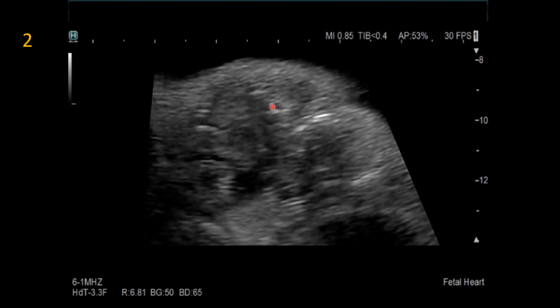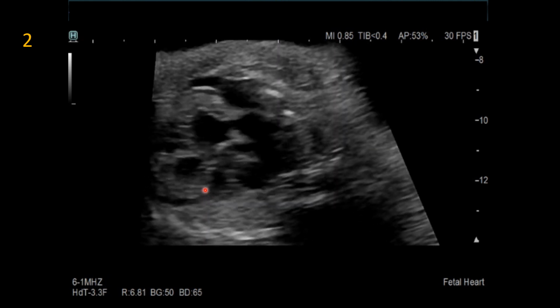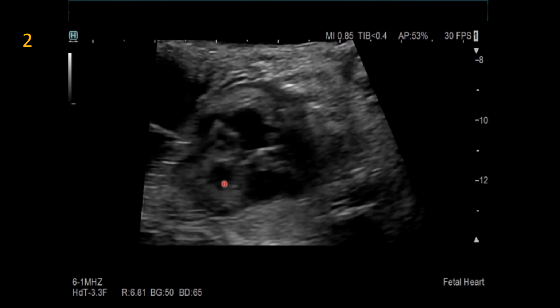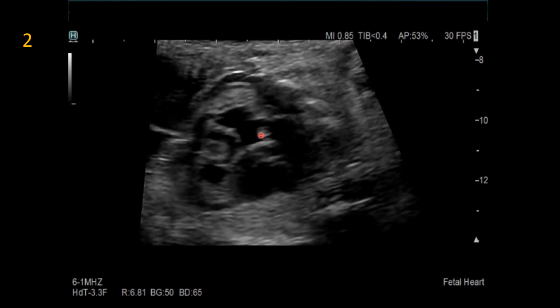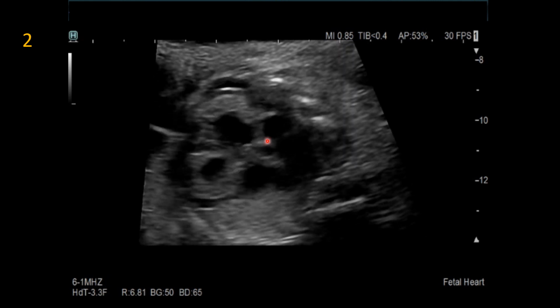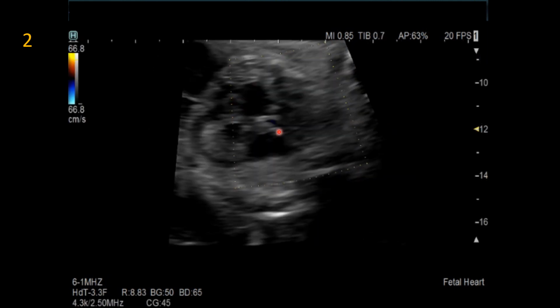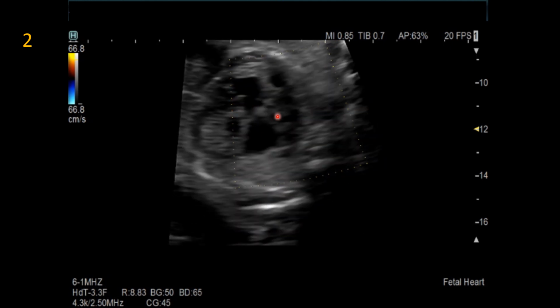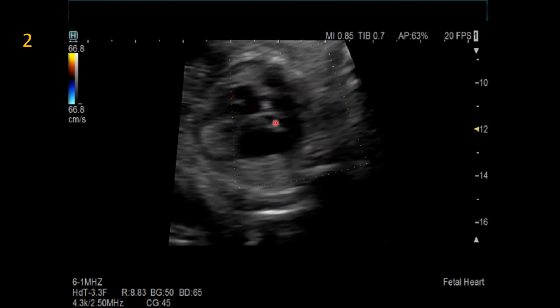Different angle. This is still sort of a parasagittal kind of an axial cut here. You see the left ventricle here, the right ventricle, and this outflow tract is the aortic outflow tract, the aortic valve here, and posterior to that is the pulmonary artery here, smaller in diameter than the aorta, but double outlet right ventricle here with color Doppler. You can see antegrade flow, non-accelerated antegrade flow through both of those vessels. So the pulmonary artery is patent, but looks narrowed here.